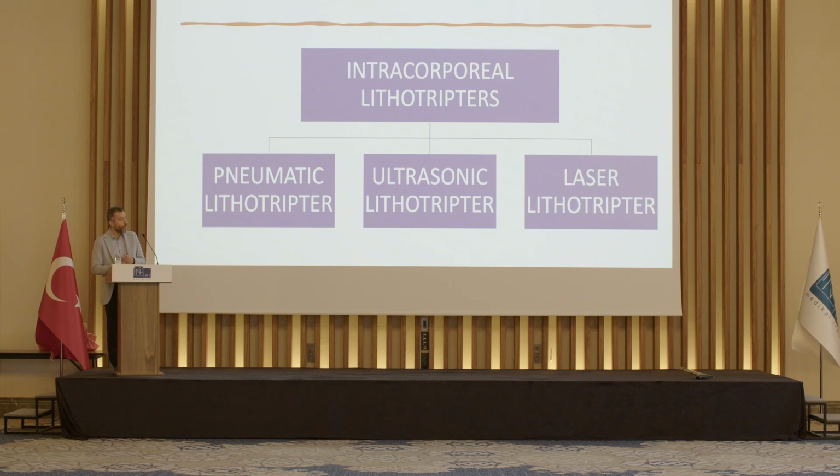So for this one, we need the intracorporeal lithotripters for our procedures. We need to disintegrate the stones inside the body. So we have the ballistic pneumatic lithotripter, the ultrasonic one, and also the lasers. I'm not going to get into the details of the lasers. It's beyond the scope of today's presentation, because for each laser, actually, I can give a 1 hour talk with the technical differences and everything, but I will mainly focus on pneumatic and the ultrasonic lithotripters.